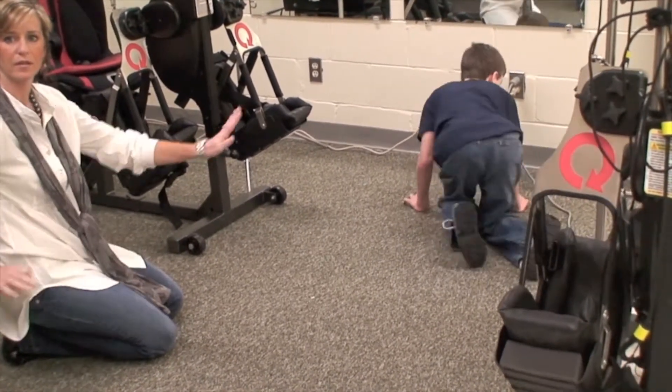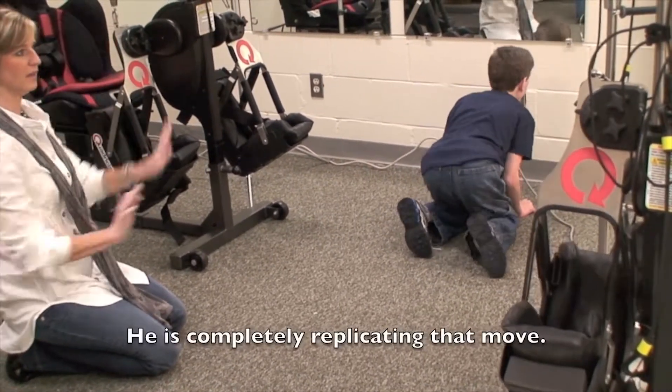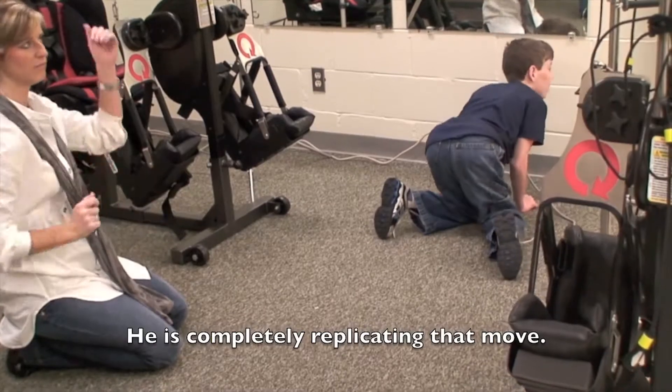Cross crawl pattern — right. And that's what he was doing, and that's what that machine is doing. Normally he bunny hops. If he needs to get from point A to point B fast, he's going to bunny hop. That's how he gets there.